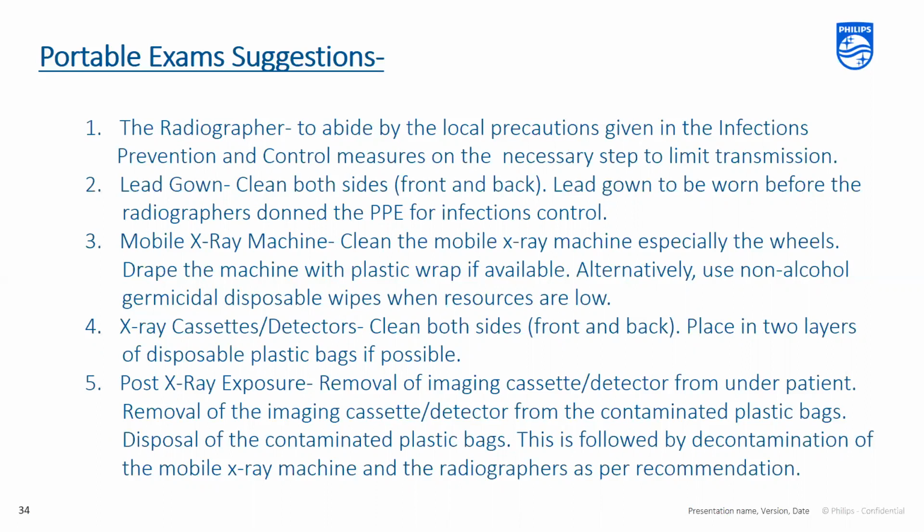Be sure to clean both sides of your detector or x-ray cassettes, and if you can, place them in 2 layers of plastic bags. Once you make your exposure, remove the cassette from under the patient and the detector from the bags, dispose of the contaminated bags, and then follow with cleaning your x-ray machine and your equipment as recommended.